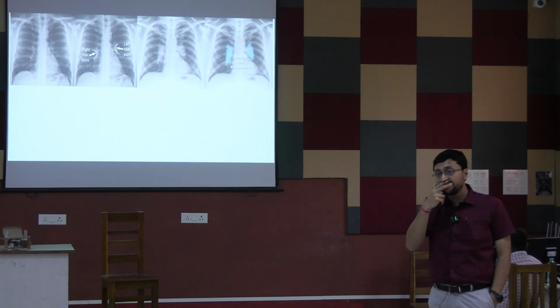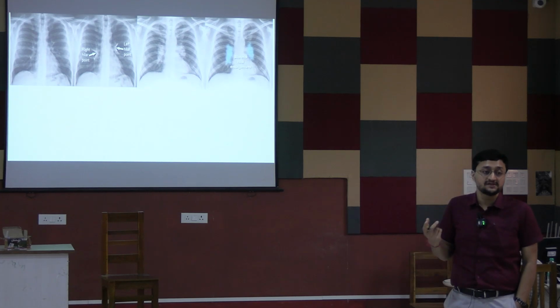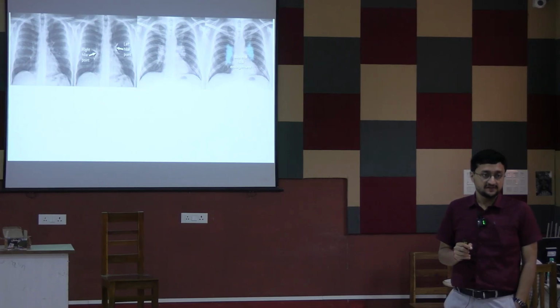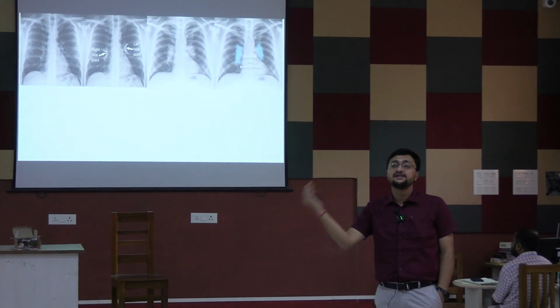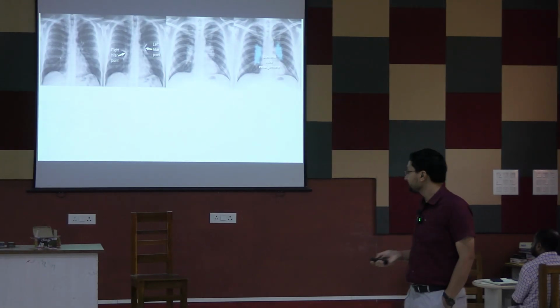So bilateral hilar lymphadenopathy যদি থাকে কোনো পেশেন্টের, তাহলে কি সাসপেক্ট করবি, কোন ডিজিজ সাসপেক্ট করতে পারবি? টিবি ডেফিনেটলি, দেন সিলিকোসিস ডেফিনেটলি, and sarcoidosis. Very important differentiating point. So যদি তোকে কোনো এক্সরে দেখিয়ে বলে, ধর এক্সামিনার জিজ্ঞেস করলো যে কি কি ডিডি, তুই বলবি টিবি, সিলিকোসিস and sarcoidosis.